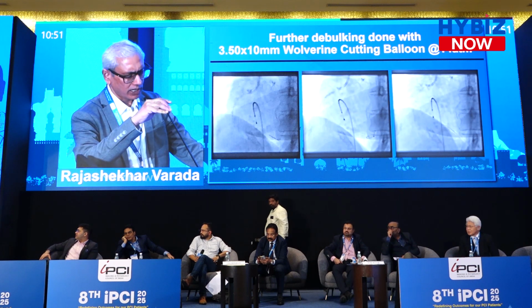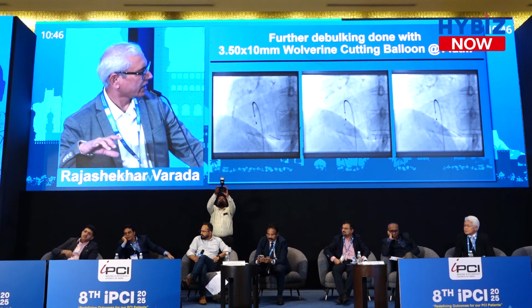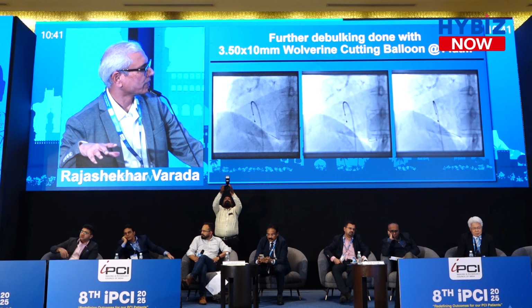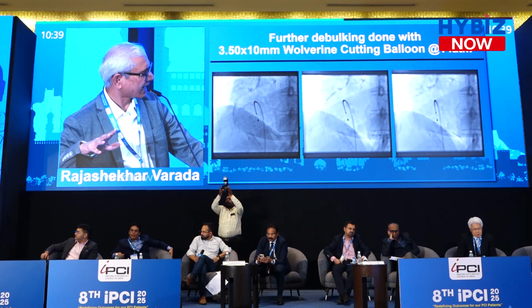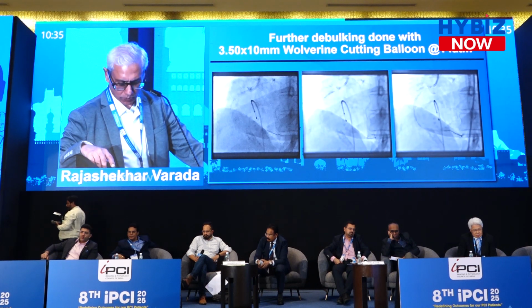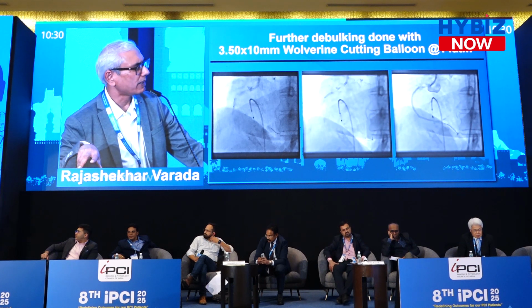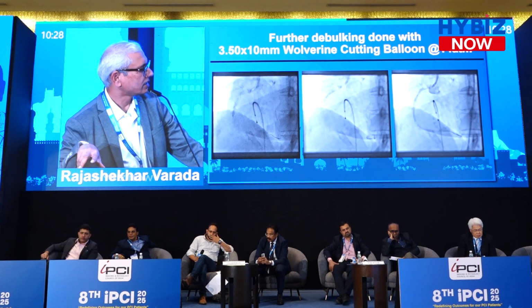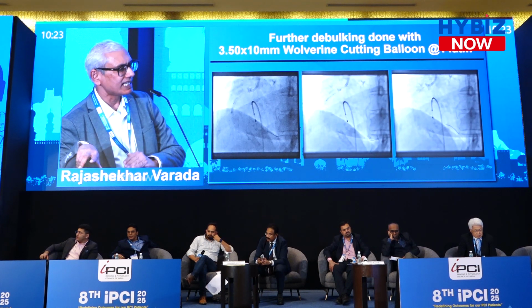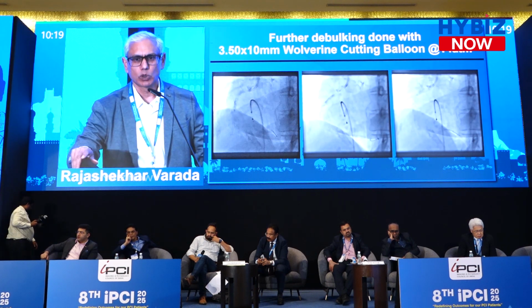The reason I opted for IVL is because I did find on the IVUS areas where there was an uninterrupted more than 180-degree arc of calcium. There are places where the calcium was cracked quite handsomely, and places where there was more than a 180-degree arc. So normally when we do this complex intervention, we go with the maximal strategy, because there is no point in doing a half-hearted job and coming back, no point de-escalating and re-escalating. We go with the maximal strategy that is most likely to work.